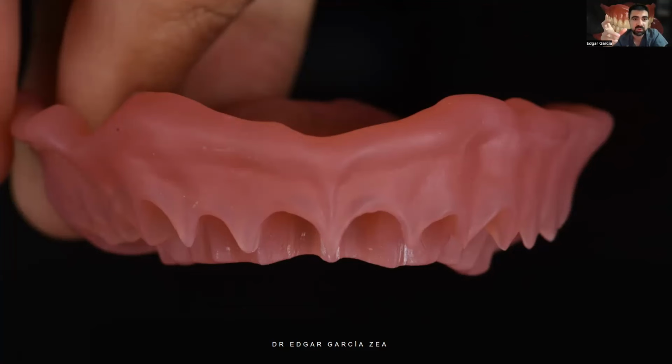So that's where I looked at what I think, and we all know, is the future of digital dentistry, which are the printed ones, okay? The printing of our restorations, okay? There are a lot of resins that many companies offer you to make dentures, but most of them do not have the properties to make a complete full denture that's going to be there for many years.